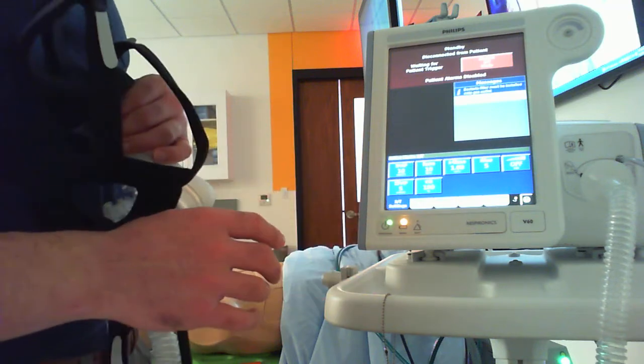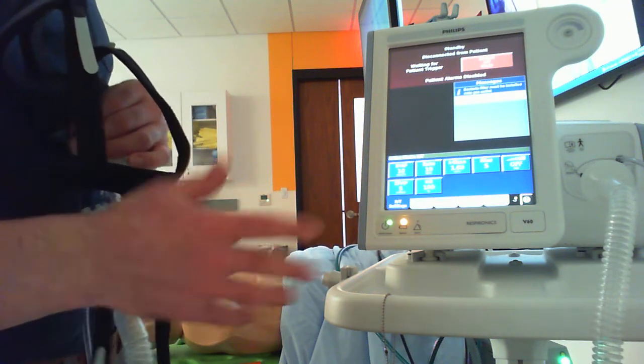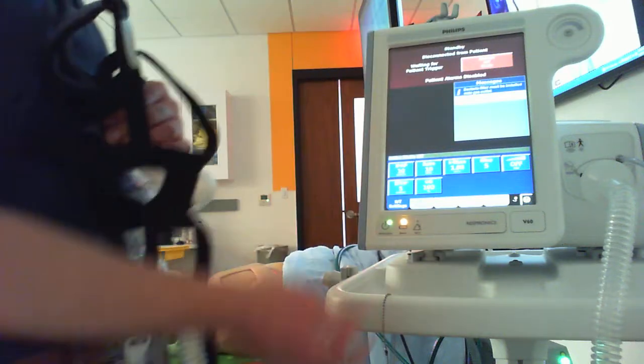1 second's a pretty good I time for most adults in pressure ventilation. 0.8 to 1 second would be a good setting. I usually leave that at 1.